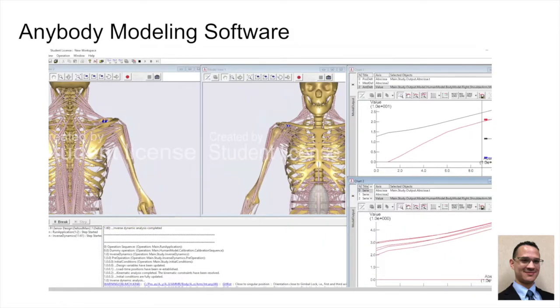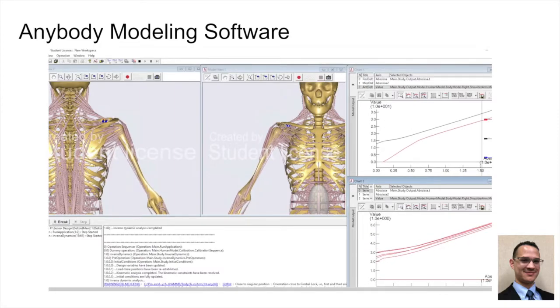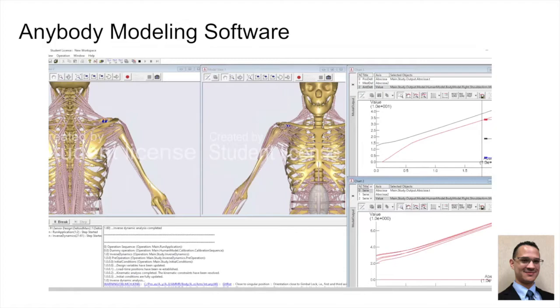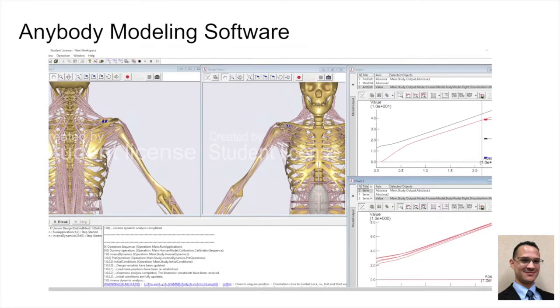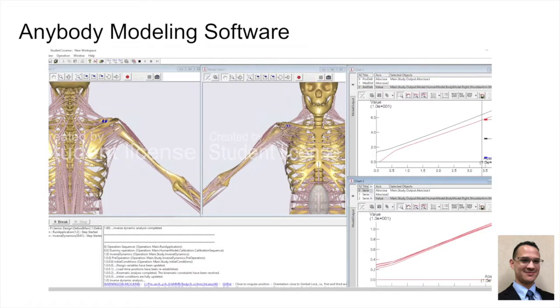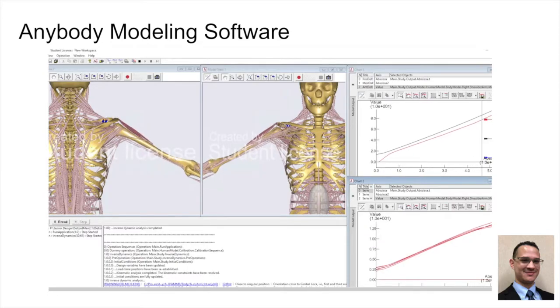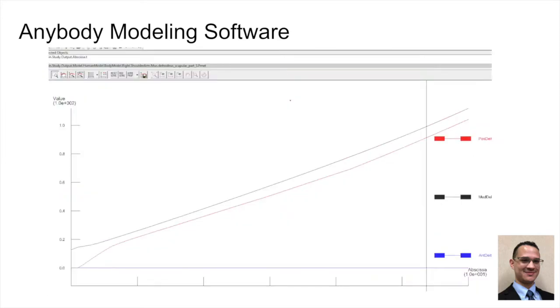On the left, you will see the anterior and posterior views of the 3D rendering of the model's right shoulder. On the top right, you will see the force output from the 3 deltoid fibers that were modeled at the Musculoskeletal Institute. And on the bottom right, you will see the force output from the supraspinatus muscle fibers. This simulation is of a patient with a massive tear to their rotator cuff, with only the deltoid and supraspinatus muscles active. You will notice that the force output curve will continue to rise as the abduction angle reaches 60 degrees. Here is a closer look at the force output curve of the deltoid.